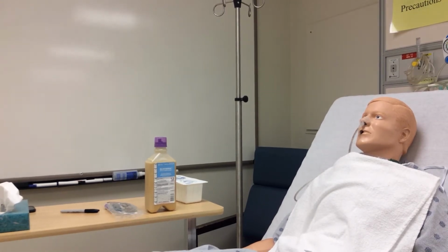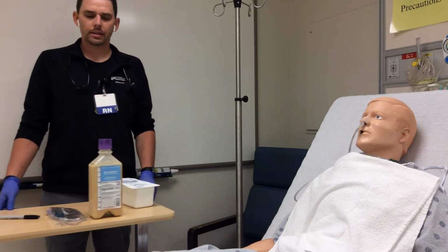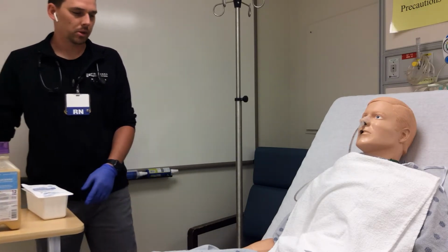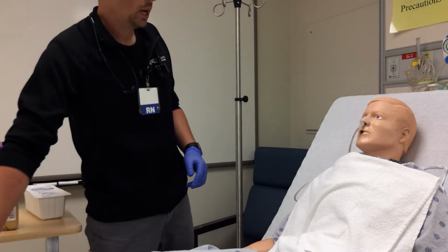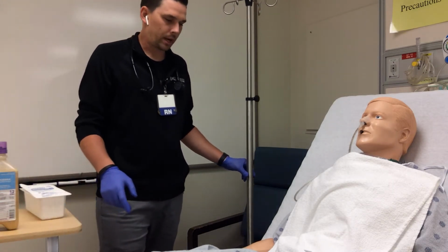This video will demonstrate continuous enteral tube feeding. It has a lot of similarities to intermittent tube feeding, but also some differences that we want to make note of. So figured we'd make a video to get you guys comfortable if this arises in clinical.